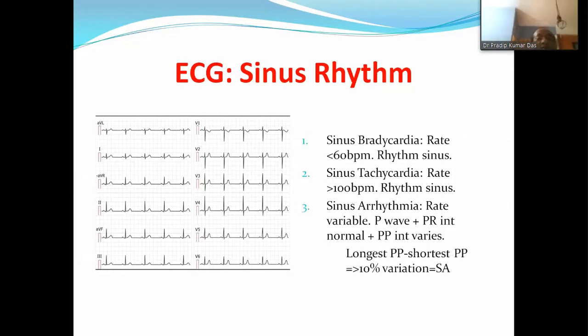It is an ECG of sinus rhythm, and all I told here about the sinus rhythm earlier. P wave, normal QRS-T, and rate is normal. Everything is normal.